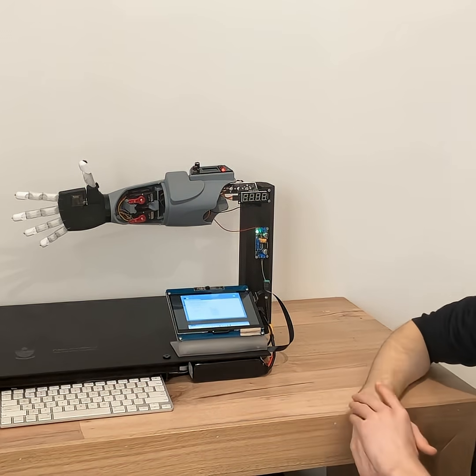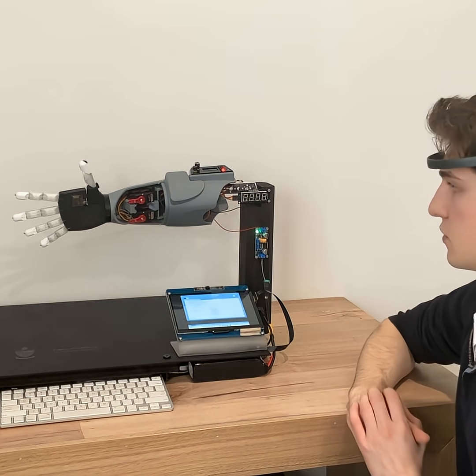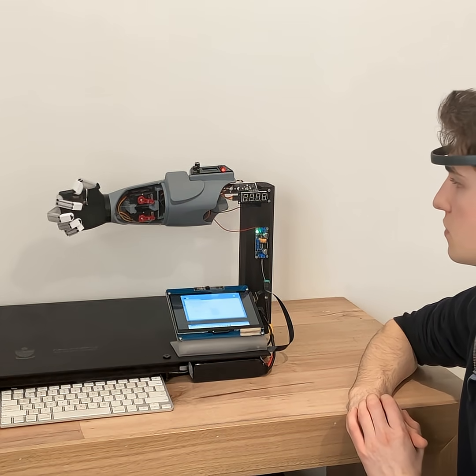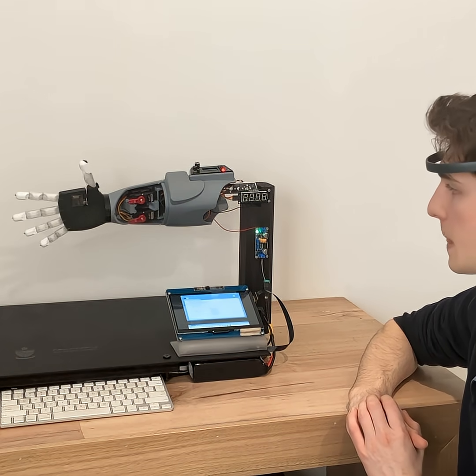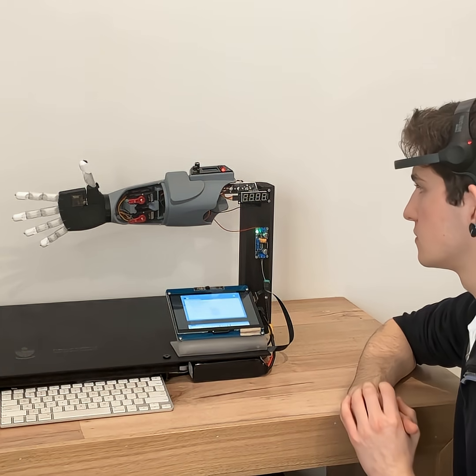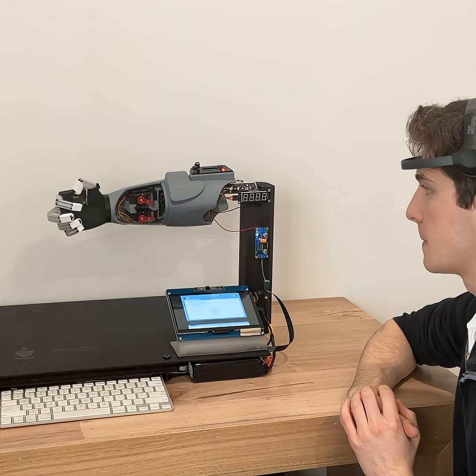I'll show you that now. Three, two, one. And open. Three, two, one. And open.